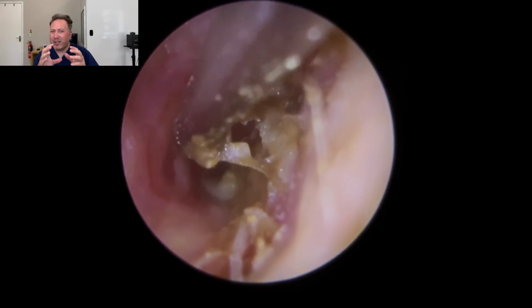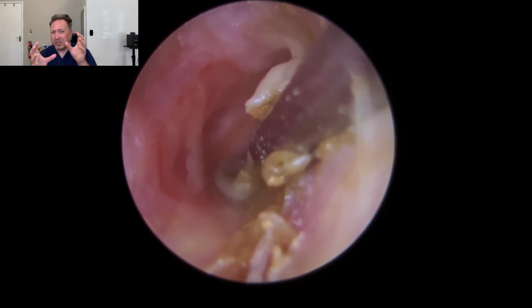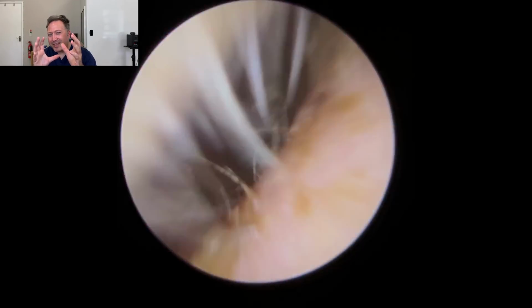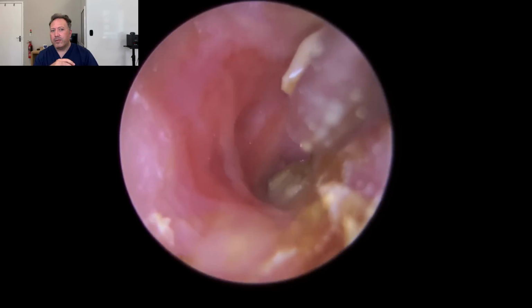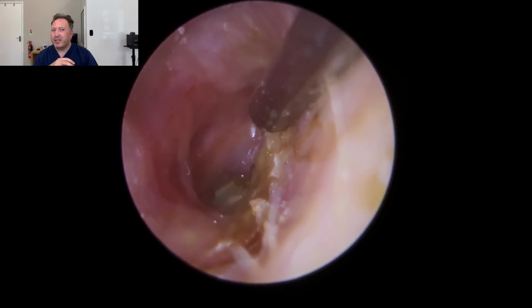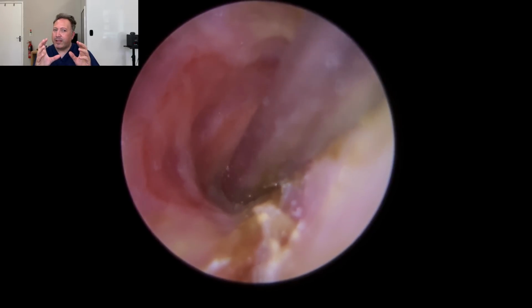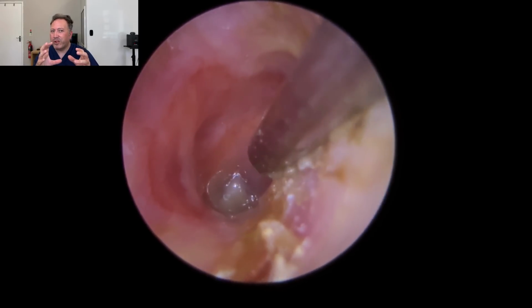Canal's a little bit on the narrow side, so difficult. I mean, this is the fine end you can see here, so it gives you some appreciation as to how big that canal is. But as you're kind of there, did you see that liquid coming away there from the base of the eardrum then? That's where the discharge is coming from. Now, based on this lady's history of perforation to the eardrum and an eardrum repair, I think what we have here, looking at this liquid that's coming away, is discharge from the middle ear space. So I think we've got another perforation here.